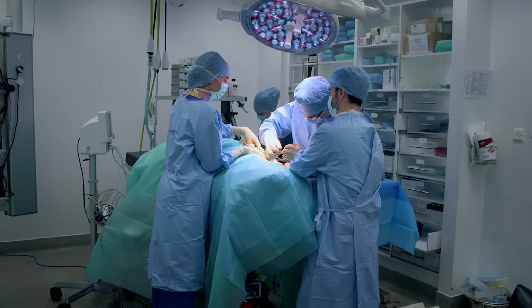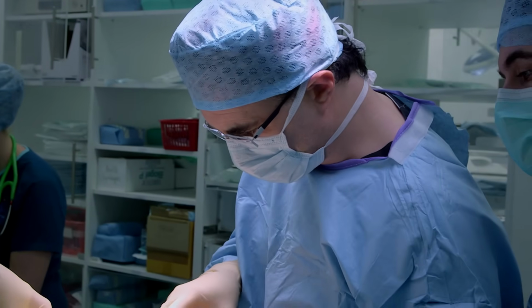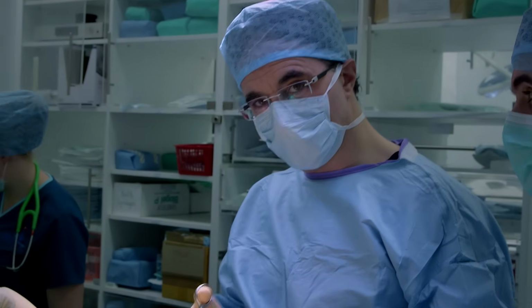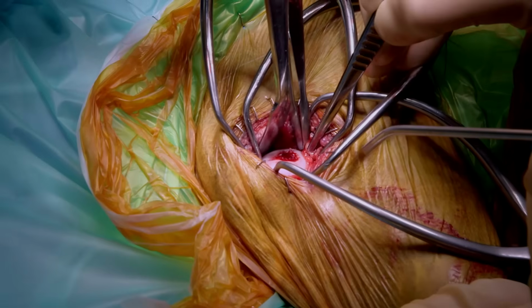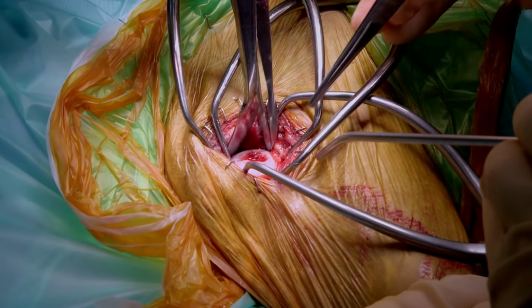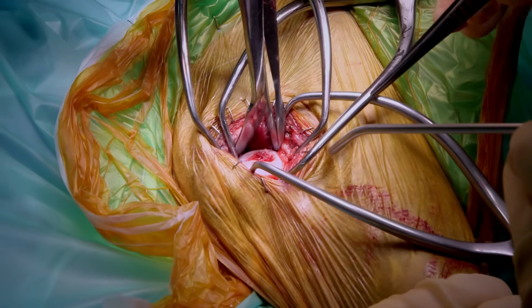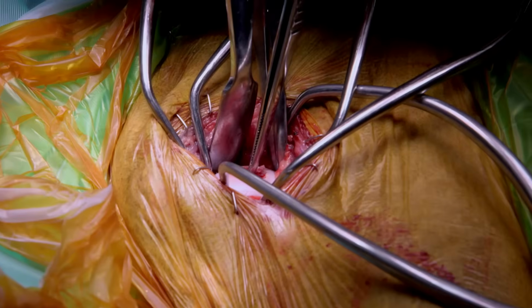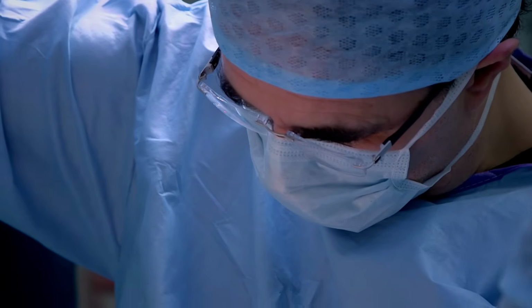This is a big day for Flo because what we do is ultimately going to determine the destiny for the joint, and obviously that's her destiny in terms of pain and arthritis for the future. Okay, so here we can see the head of the humerus, and this is the big hole in the middle. So that is literally half of the entire head of the humerus has a big hole in it, and that's what we're going to try and fill. But before we do that, we're going to have to drill a hole 8 millimeters down to put the plug in. And once the hole is drilled, there's no way back.